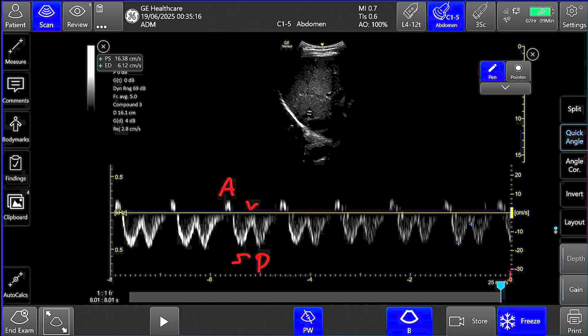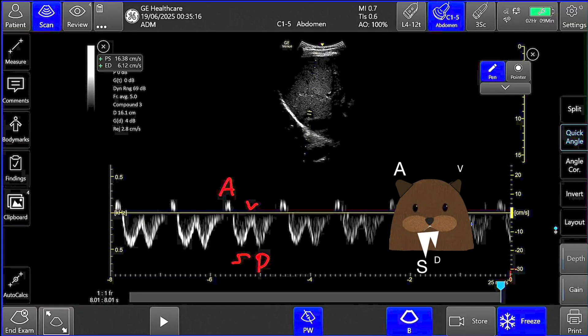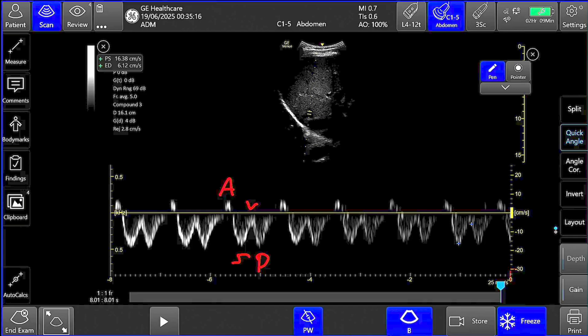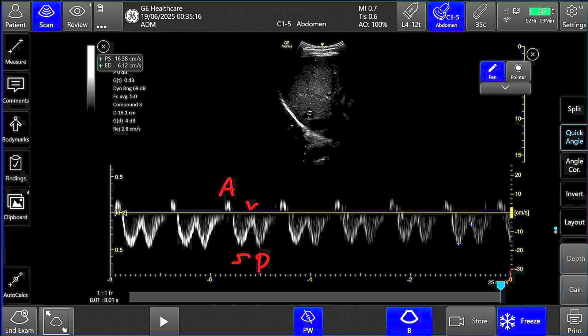Simultaneous ECG is very useful in identifying each wave. The A wave corresponds to the P wave, signifying right atrial contraction. The S wave corresponds to the QRS complex. The V wave occurs at end-systole, and the D wave occurs during ventricular diastole, after the T wave, with blood flowing from the hepatic vein into the IVC back into the right atrium. Normally the amplitude of the S wave is greater than the D wave, but as right atrial pressure increases, the S wave diminishes and may reverse above the baseline. In this demonstration, the S wave is equal to the D wave, indicating no congestion.